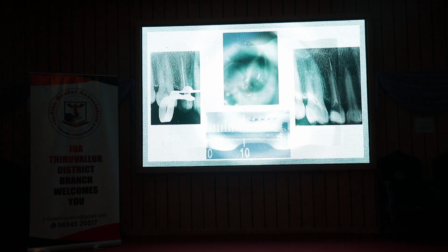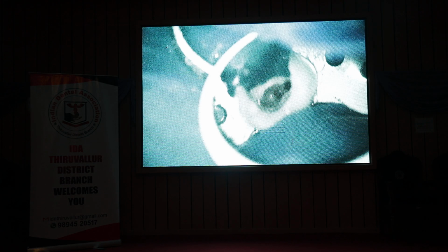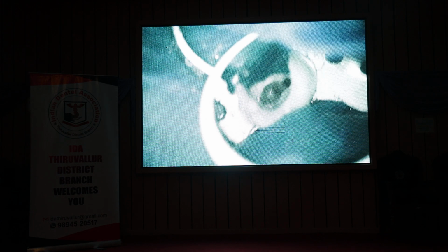Another case wherein the instrument is broken, it has slightly gone beyond also. I attempted the retrieval, but this also happens. 3/4 of the instrument came out and the other half is lodged inside. We'll just see this video also.